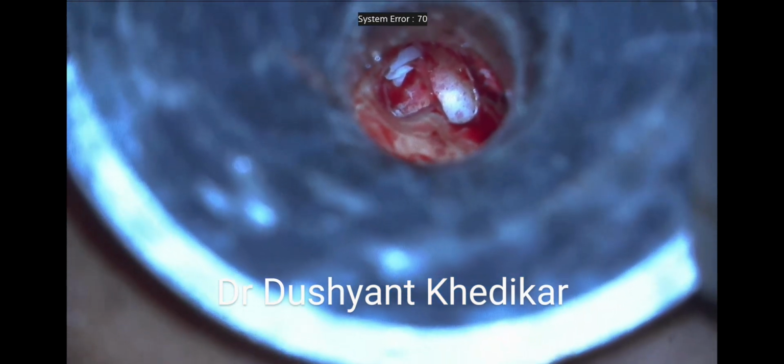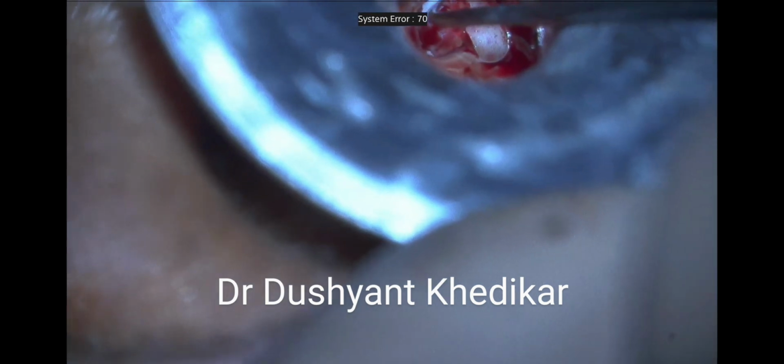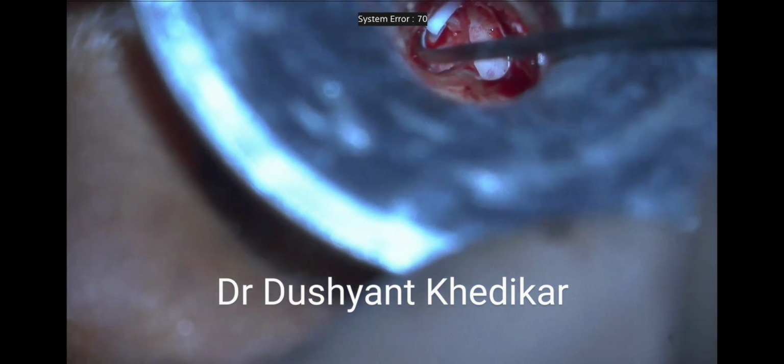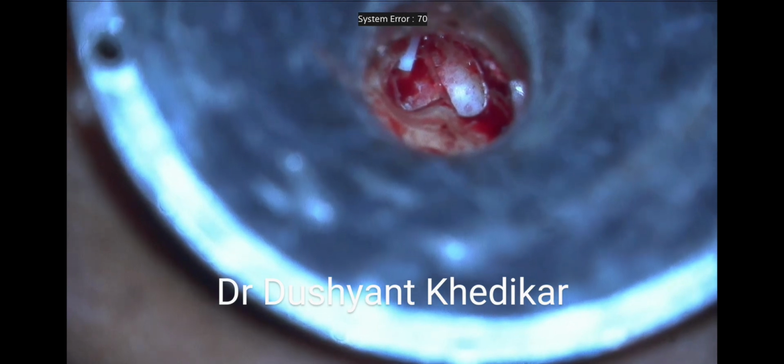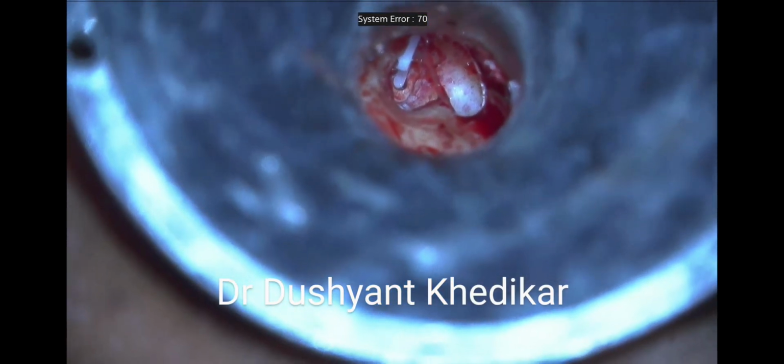The piston is placed as perpendicular as possible into the fenestra and looped onto the long process of incus. It is gently maneuvered using a pick. Now gently suctioning out the accumulated blood over the footplate, the position of the shaft into the fenestra is confirmed.